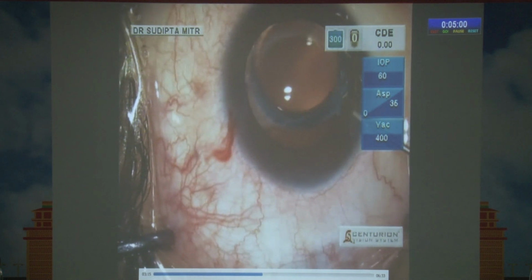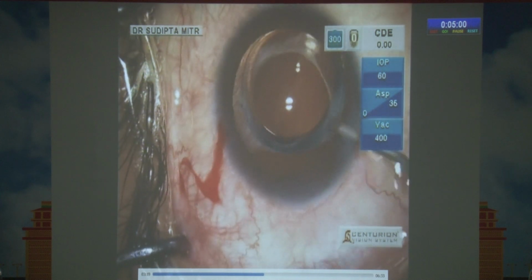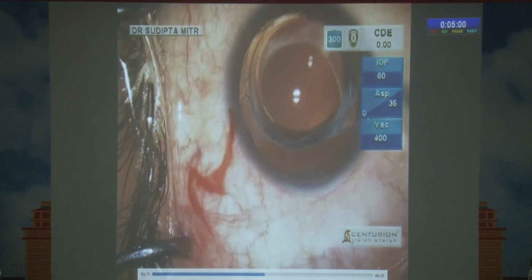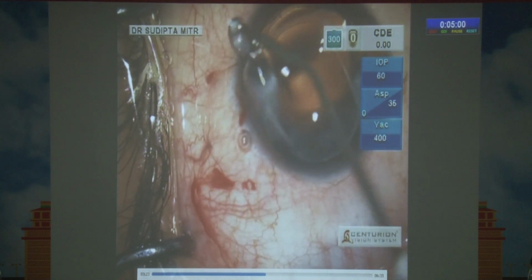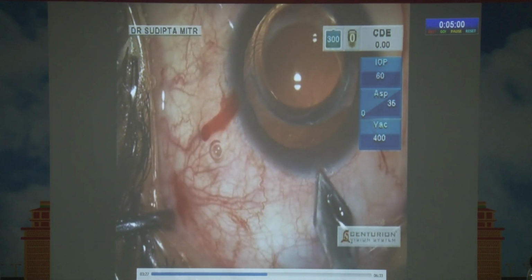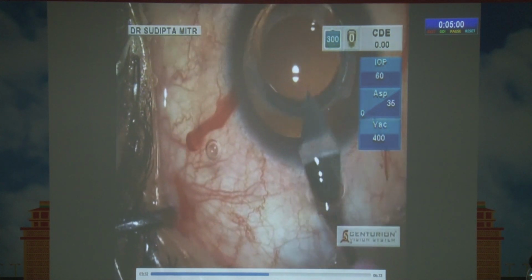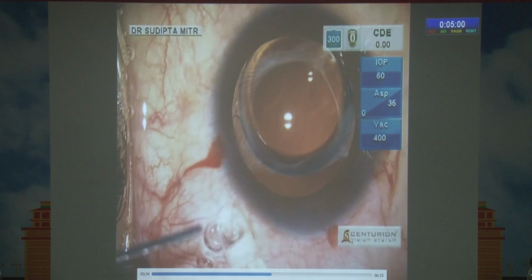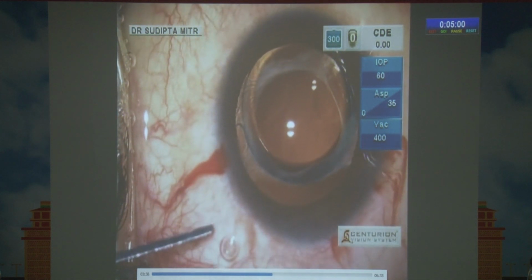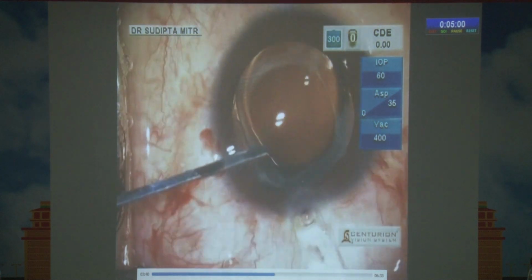And just like a phakic IOL, we had already folded the lens. This was not a pre-filled one. We inflated the anterior chamber with a sufficient amount of viscoelastic, not too much, not too little. This was nearly at the limbus, in a clear cornea, and this injector is a 2.8 millimeter injector. So the steps were more or less similar to those of a phakic IOL.